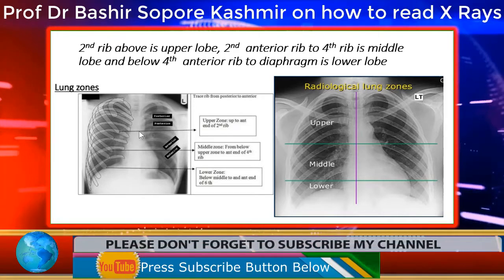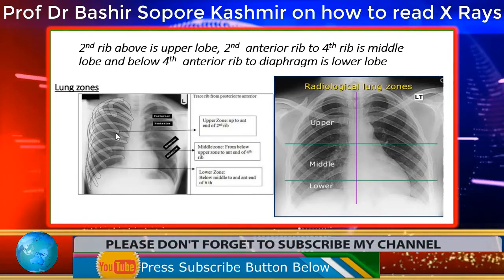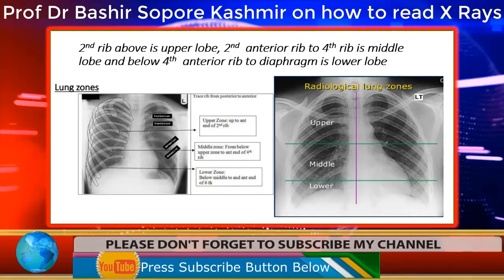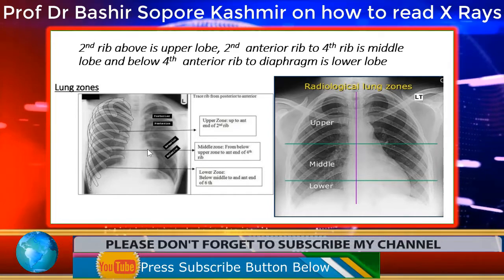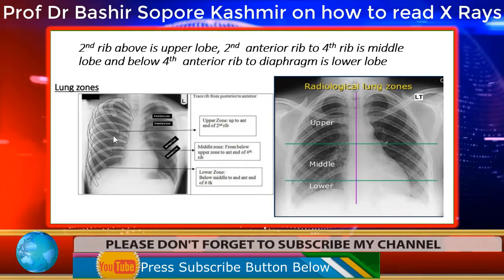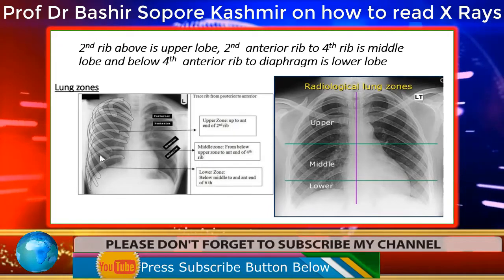Now the upper zone is that if we draw a horizontal line like this at the anterior end of the second rib. So this is the first rib, this is the second rib. You draw a horizontal line like this at the anterior end of the second rib. Above this will be the upper zone. And if you draw another line below at the anterior end of the fourth rib, so this is the anterior end of the fourth rib. Between the second and the fourth rib will be the middle zone, and below the fourth is the lower zone. So this is how we should divide the lungs on X-ray into different zones.